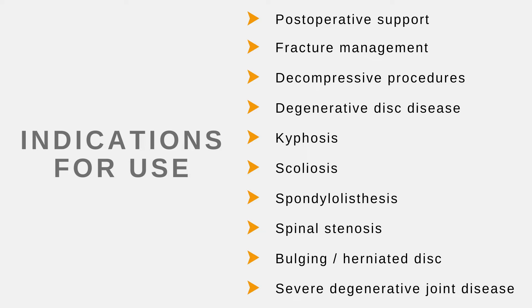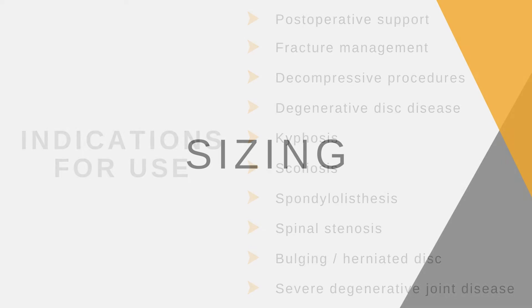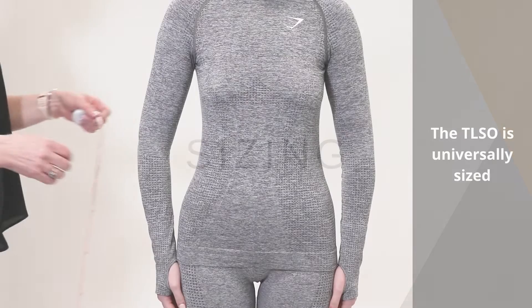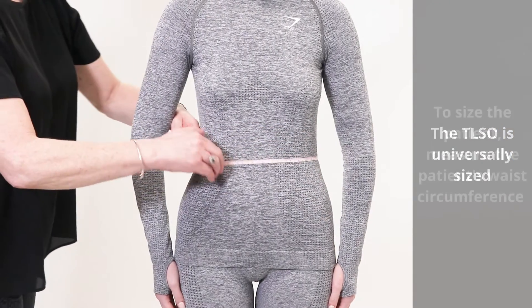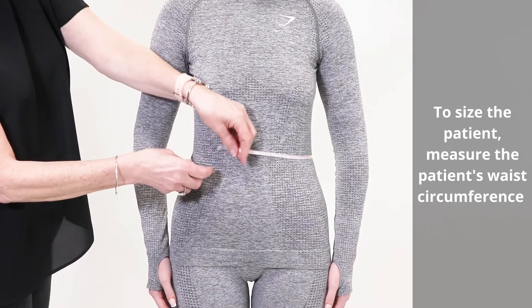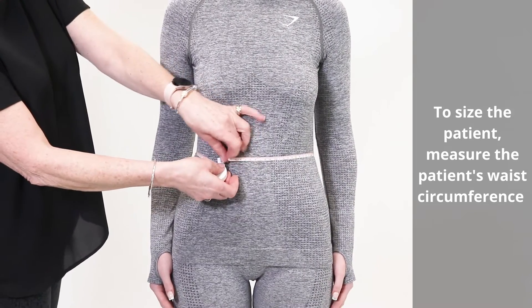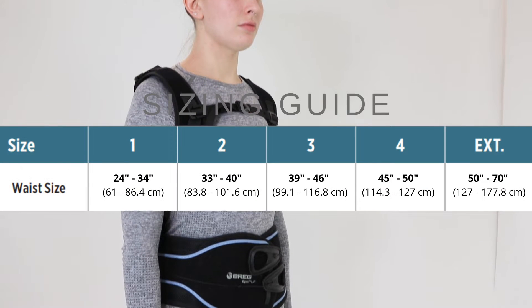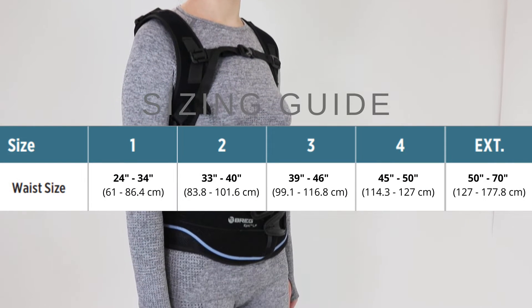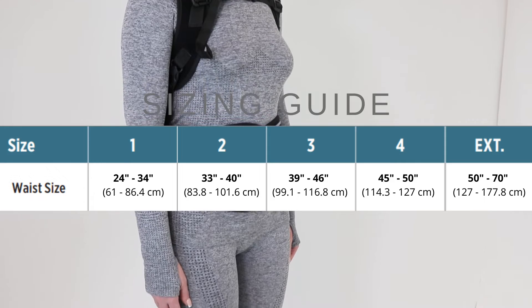The TLSO is universally sized. To size the patient, measure the patient's waist circumference. Reference the instructions for use to determine which size to adjust the waist belt to.